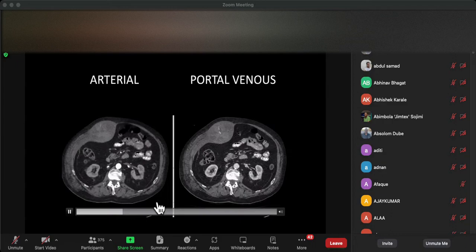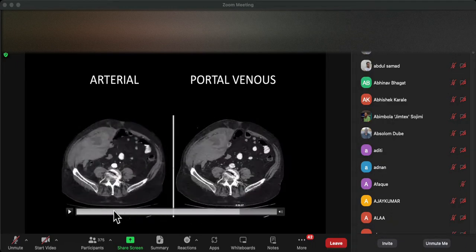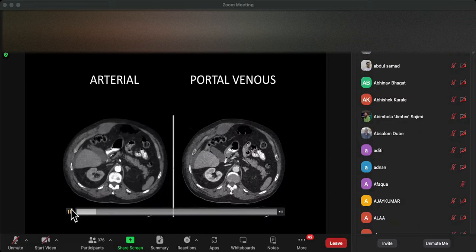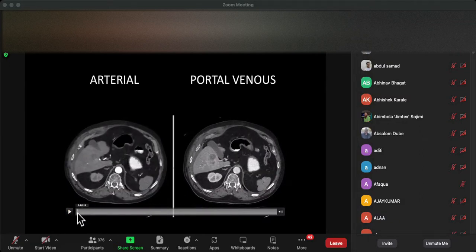And if we look in the liver, there's also a liver lesion just here. Now, the liver lesion could be a hemangioma, or it could be a neoplasm, which is a bit more sinister. We haven't got enough information, really. Small amount of ascites.